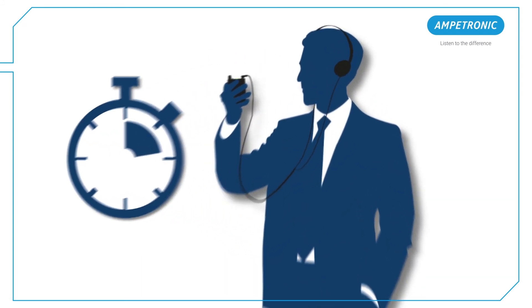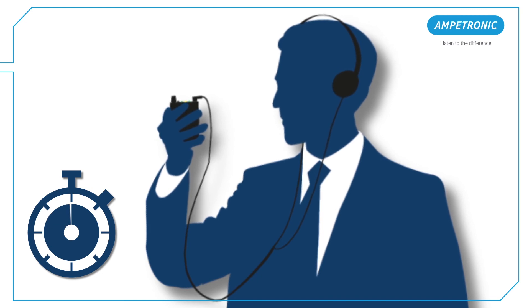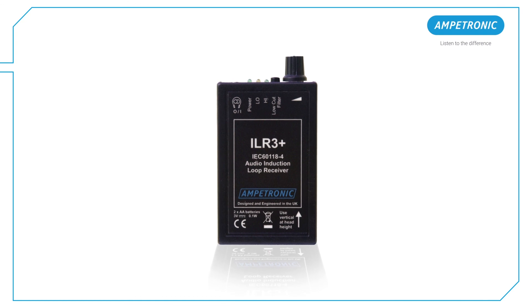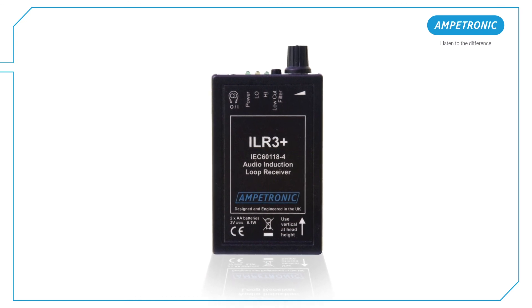Ensure you watch and listen for at least 60 seconds to get an accurate indication of field strength. Make sure you keep the ILR3 Plus vertical at all times.